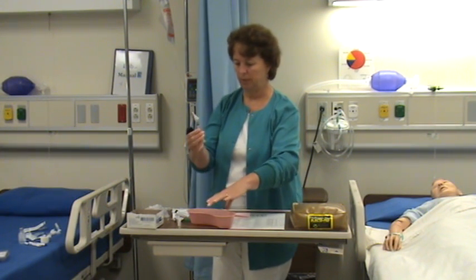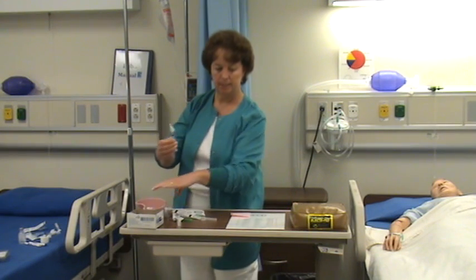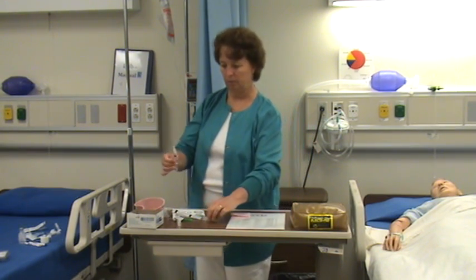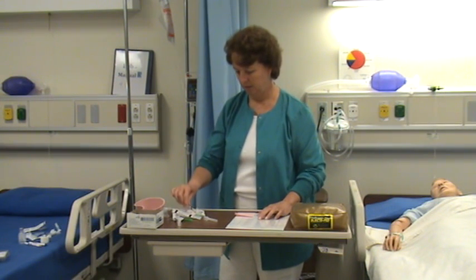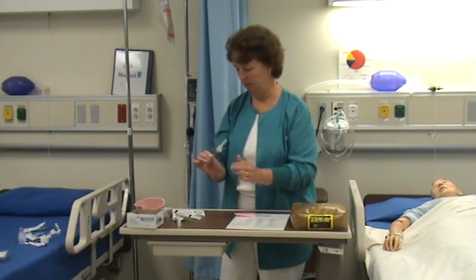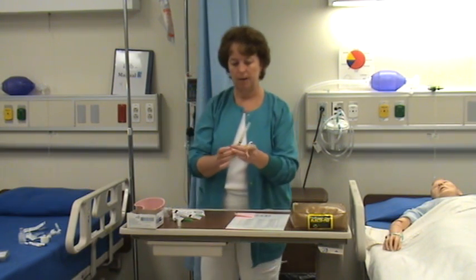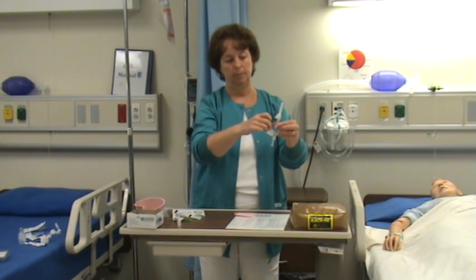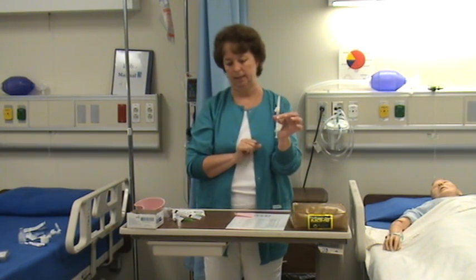Now I have 0.8 milliliters. I've done my second check with the MAR — the five rights, second check. I'm going to recap this with one hand, and then label the syringe with a pre-made label. It says drug B on it.